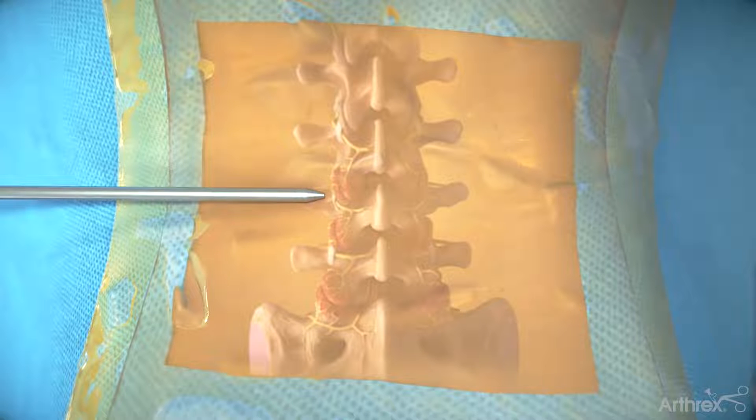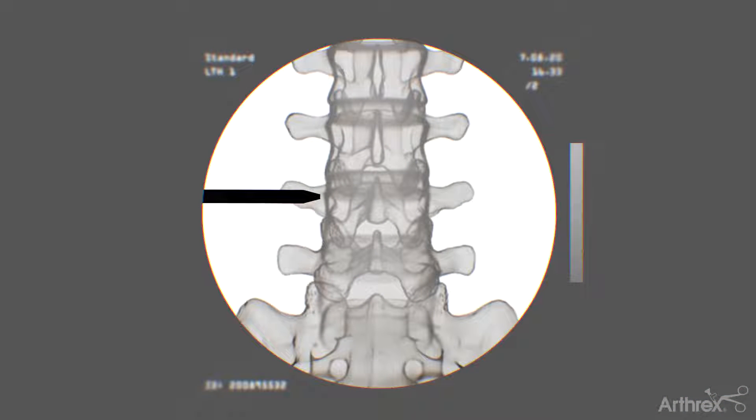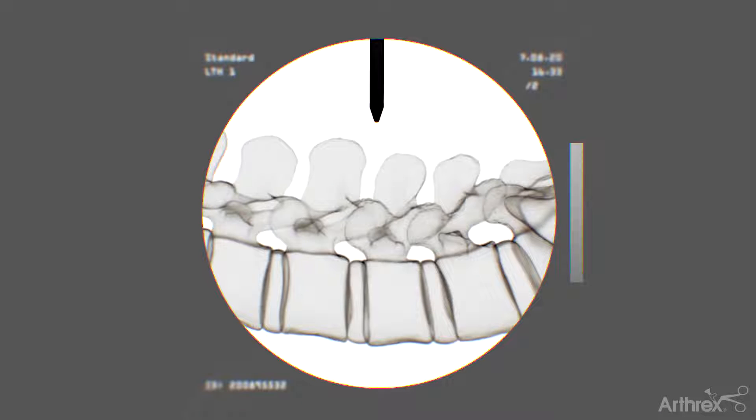Based on the preoperative MRI or CT, use the C-arm to verify the correct level or levels using both AP and lateral images.